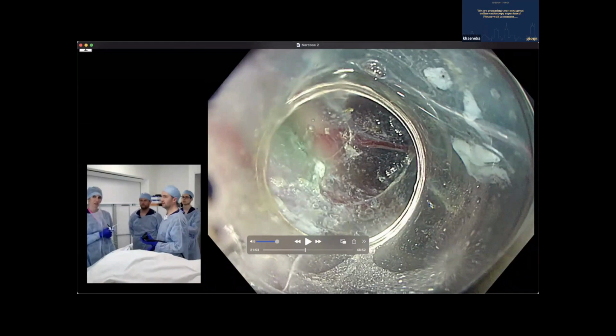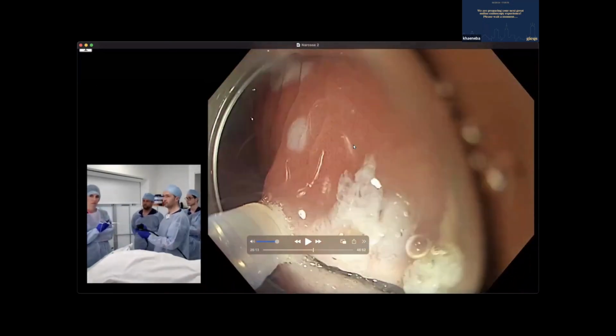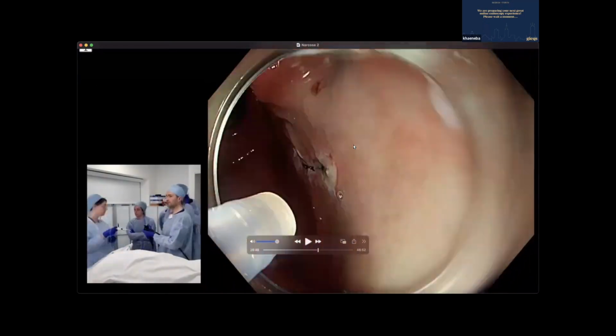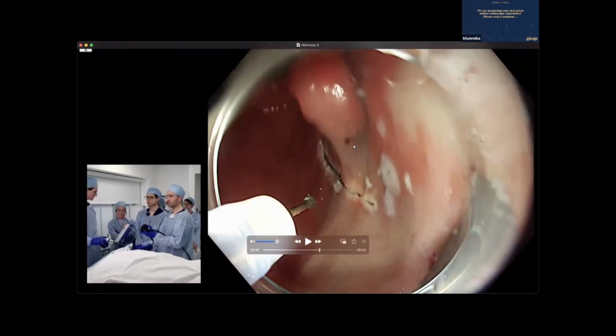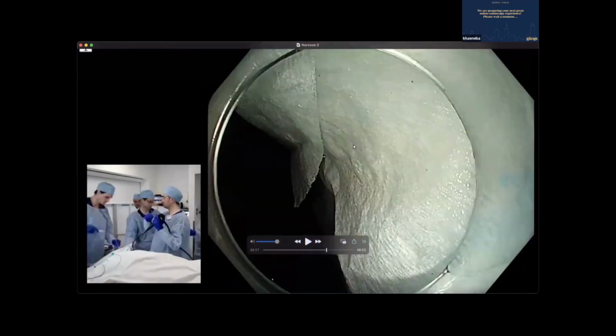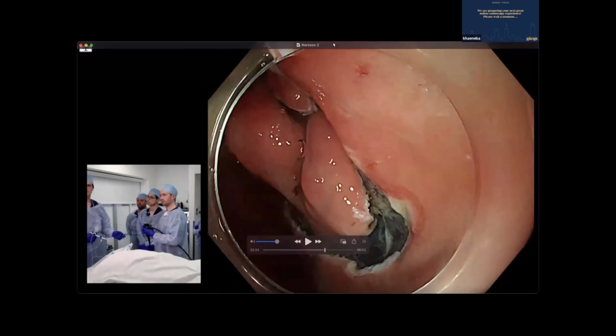It's a little bit rotated now. And then finally, cutting around it, not so much special about that, not very easy. Could have made it easier with traction probably, but the traction changed everything. Look at what it was like before the traction. It's completely compressed down. Can't see anything. Can't get under that edge. Got to really use the cap to get under there.